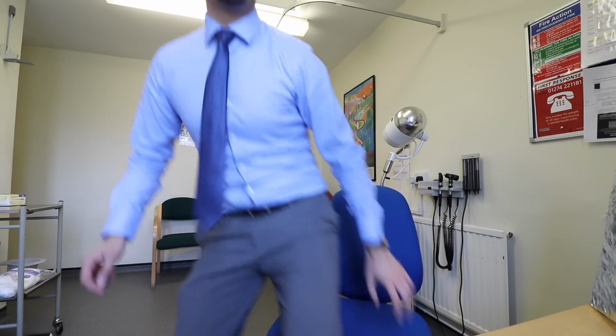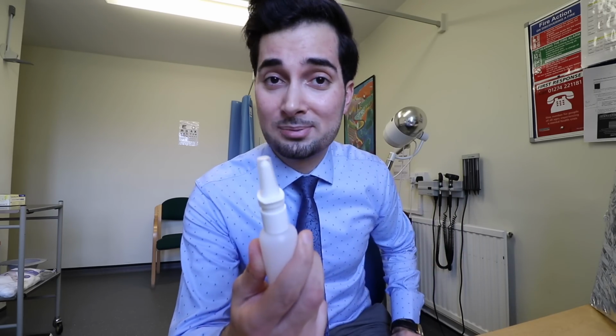If you're a pharmacist watching this video, I'm sure that scenario has happened to you loads of times. For some strange reason, patients forget to remove this cap before they use it. So if you're using a nasal spray, please remove the cap before you use it and please put it back on once you're done. And that's it! You're now a nasal spray pro.